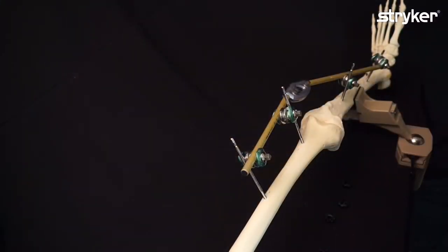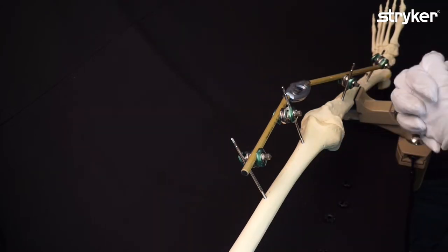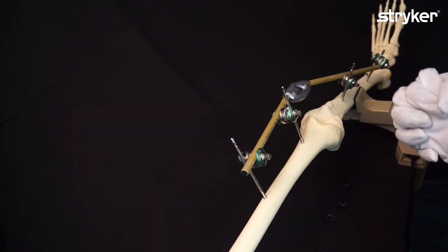Different way, efficient, less components. That's it for the knee bridging frame with the rod coupler.